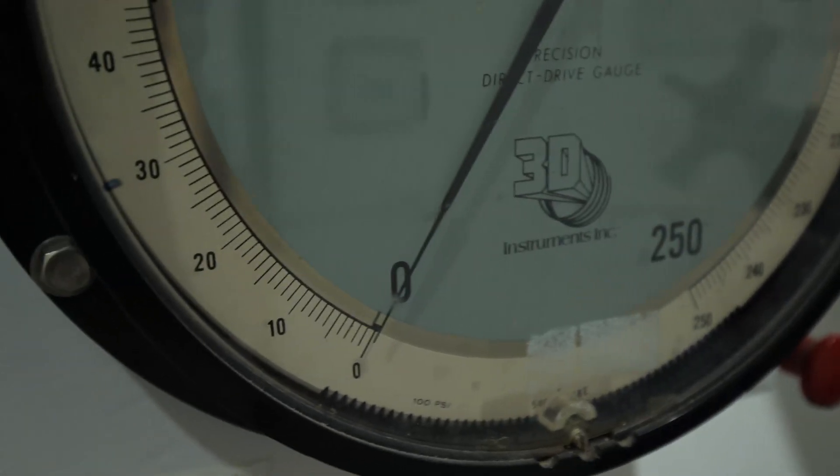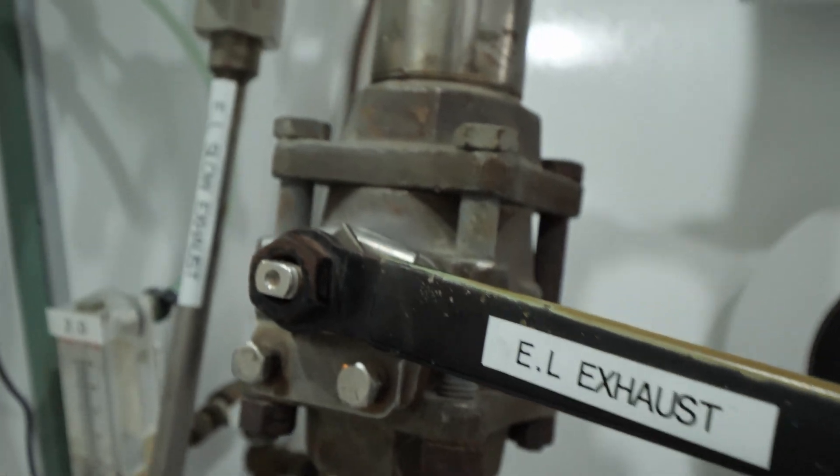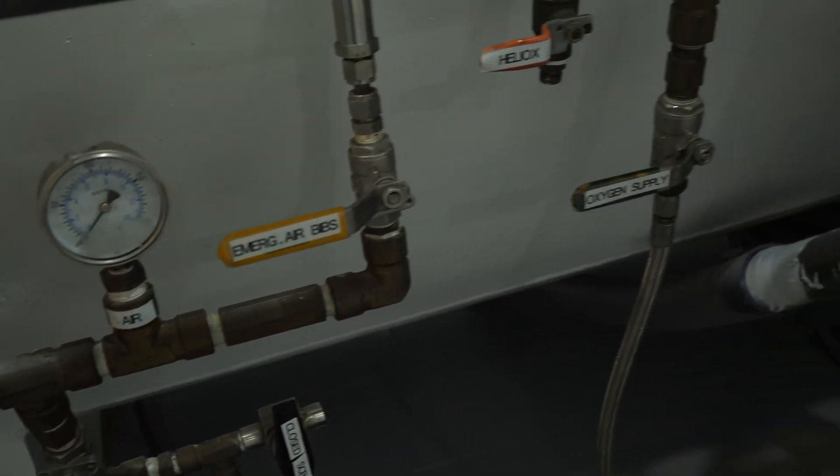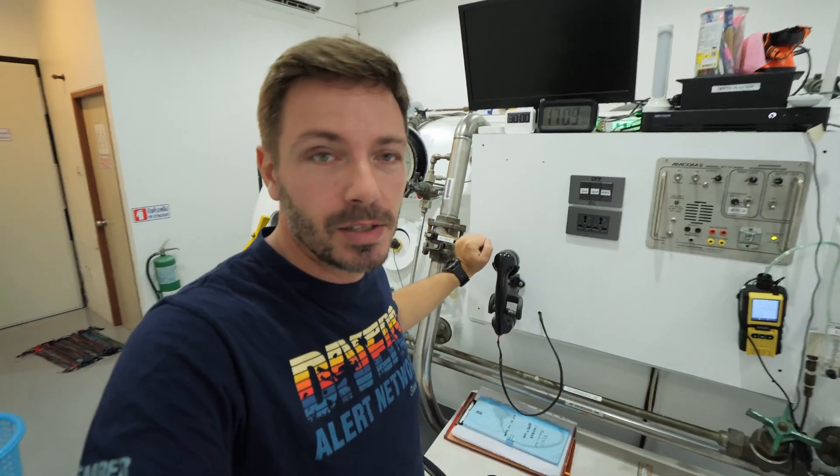What you have behind me is a hyperbaric chamber. This model is a diverse recompression chamber manufactured by Dixie in 1965 in Baltimore. It has been used ever since by different companies, the US Navy, and others. This chamber is a multi-lock, multi-place chamber, meaning you can have multiple people in there across different compartments that are independent from one another.